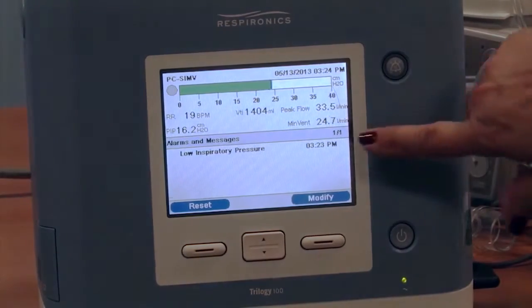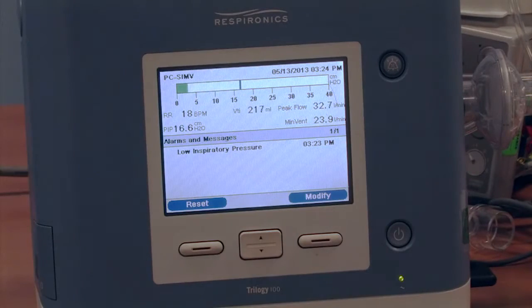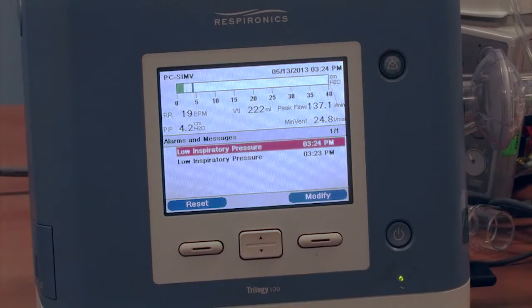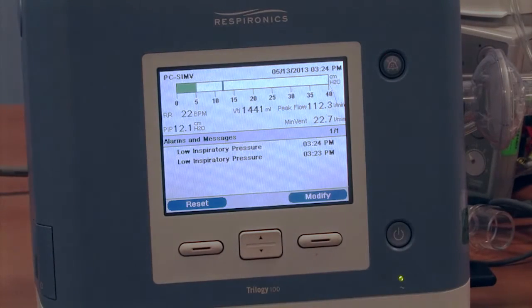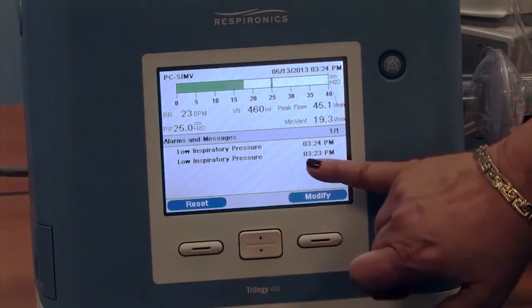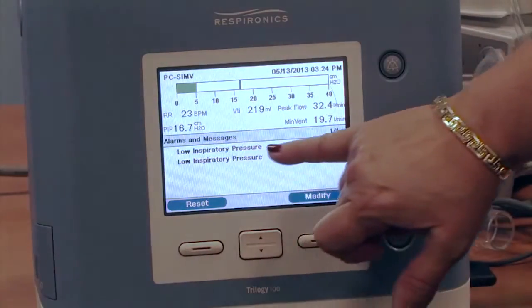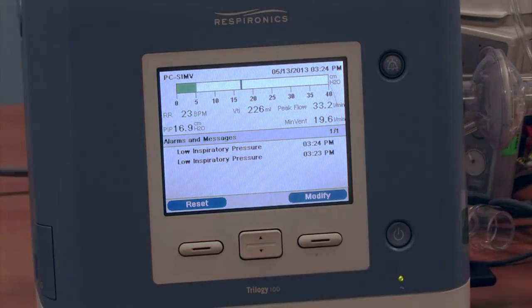This turned red, this turned red. The situation was taken care of. Somebody put your child back on the machine. They came off, it alarmed, the alarm was rectified. So there still is a menu here showing you that at 3:24 p.m. today, there was a low inspiratory pressure alarm that is now resolved.